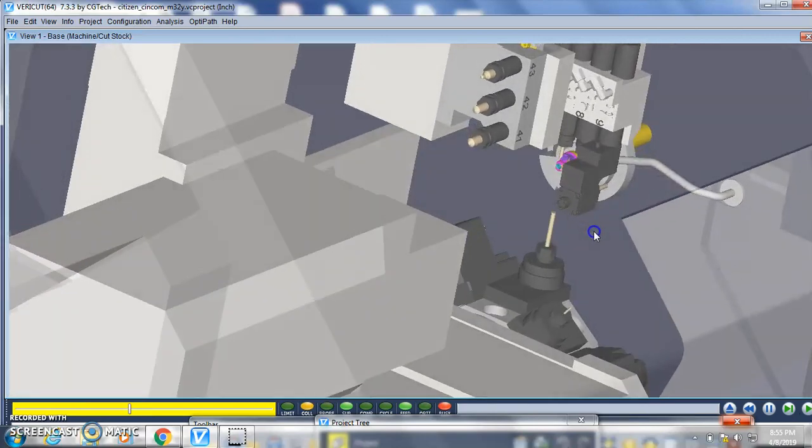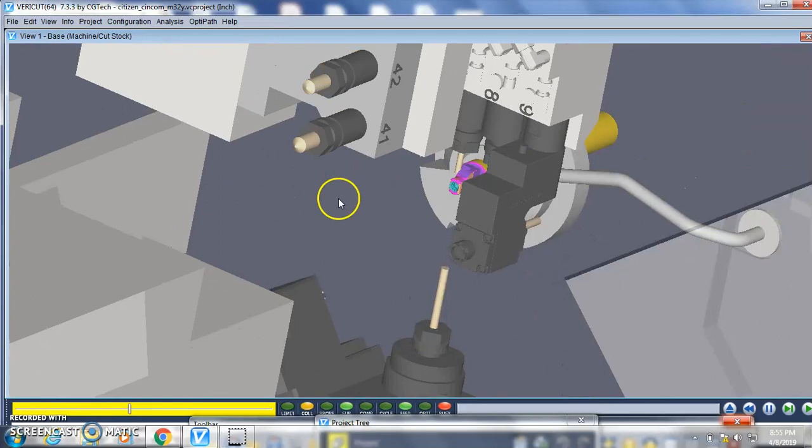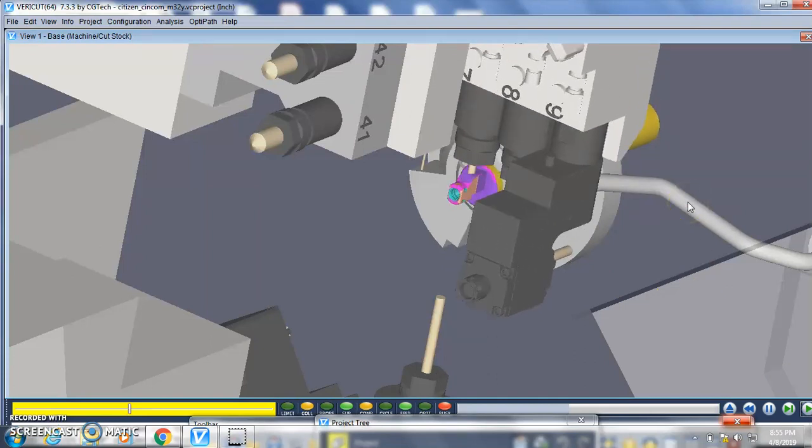So one cycle is complete. Now the sub-spindle went and spit the part out. Now the part is in the conveyor, while the main spindle has already pulled a new stock and started machining the second part.